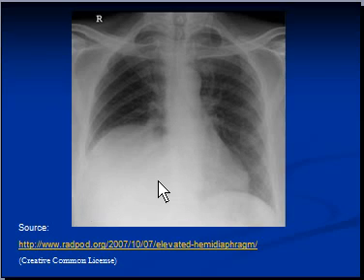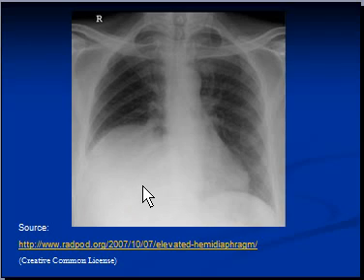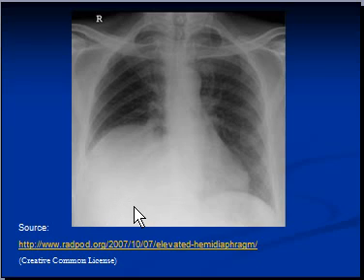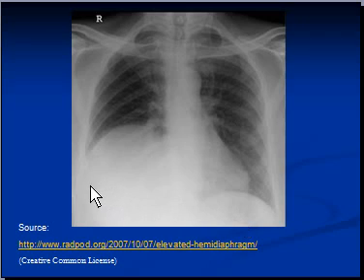If the right hemi-diaphragm was raised only by a centimeter to a centimeter and a half, we would have considered it normal. It is essential to remember that the right hemi-diaphragm is usually raised by a centimeter to a centimeter and a half compared to the left hemi-diaphragm. This is because the liver, which is under the right hemi-diaphragm, takes more space compared to the spleen and stomach under the left hemi-diaphragm, pushing the right hemi-diaphragm up slightly. The liver not only pushes the right hemi-diaphragm up, but also pushes the right kidney down. If the right kidney appears slightly lower than the left kidney on an abdominal x-ray, it is usually because the liver is pushing it down, which is considered normal.